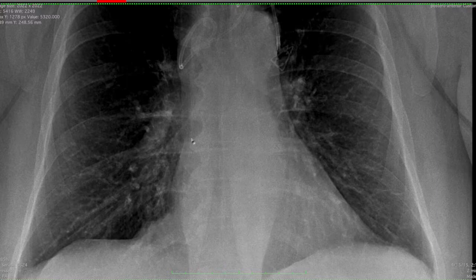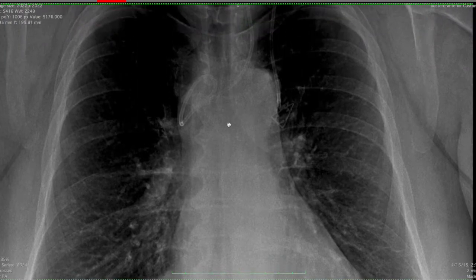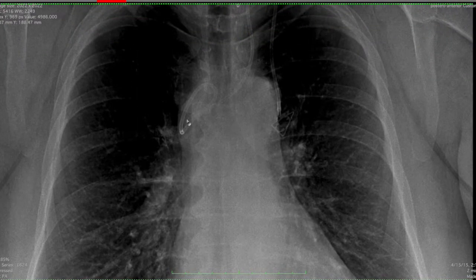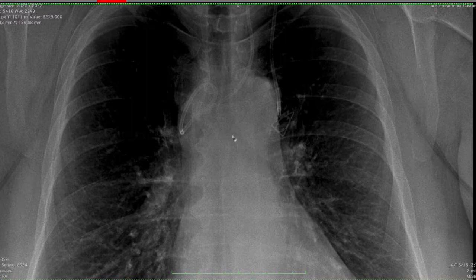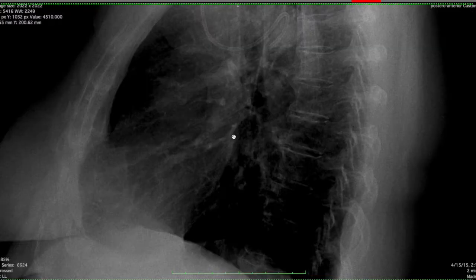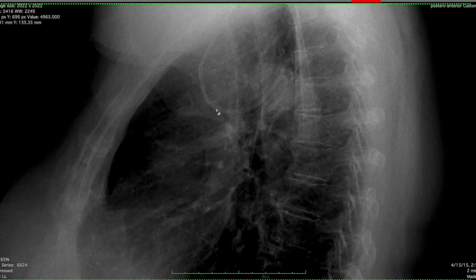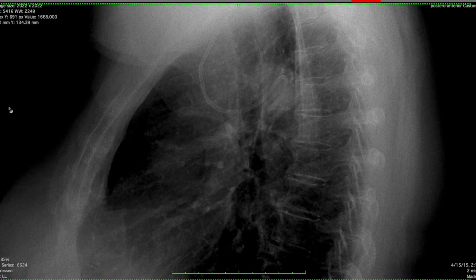I'm partial to the bronchus intermedius approach. So instead of terminating down there, we see that this line does this weird thing where it looks like it's probably a little redundant back here. This is actually a pretty classic imaging appearance. Just above the right main stem bronchus, we have the azygous vein. And on the lateral, this is the course of the azygous vein right in here, with a little bit of a loop posteriorly within the azygous system.